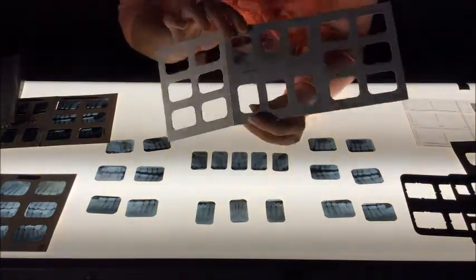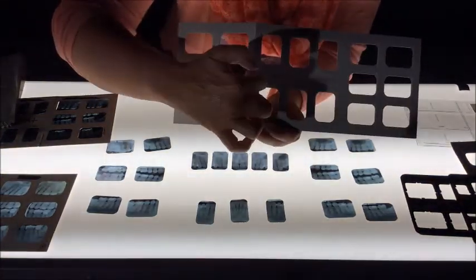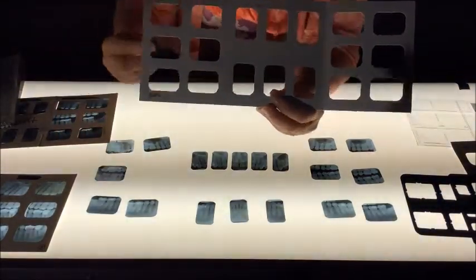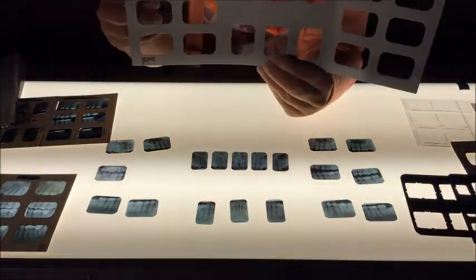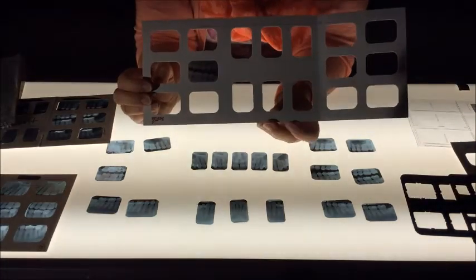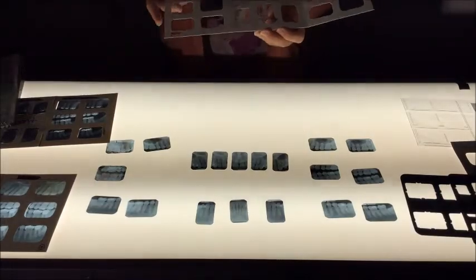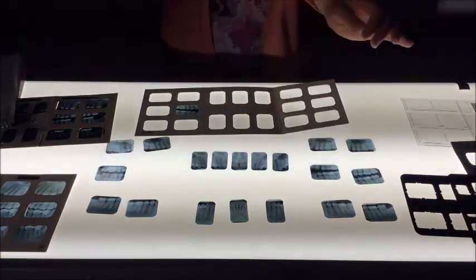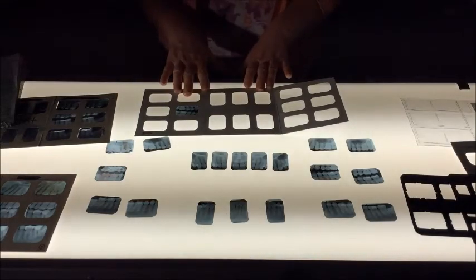When you flip the film mounts over, realize they slide into the slot, but do it while you are actually facing yourself and placing the film into the slots. You will have an opportunity to practice this during your lab. You'll have many opportunities within the next 6 weeks.